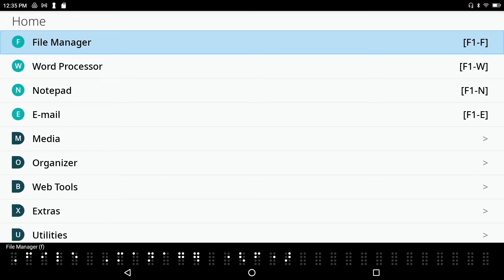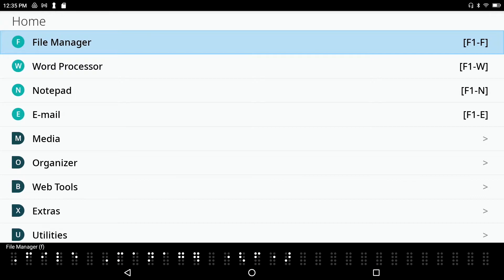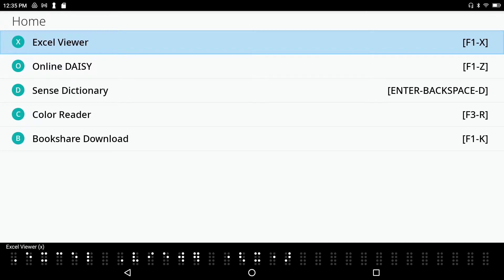The app is found within the extras menu from the main menu. I am here in the main menu. I'll press F1 to confirm that I am on the first item called the file manager in the main menu. I can press space dot 4 to down arrow through the menu system and space dot 1 to up arrow through the menu system.